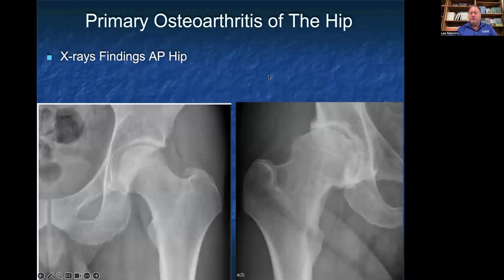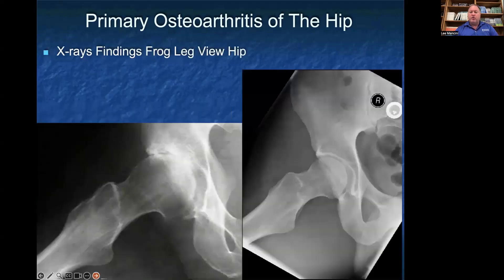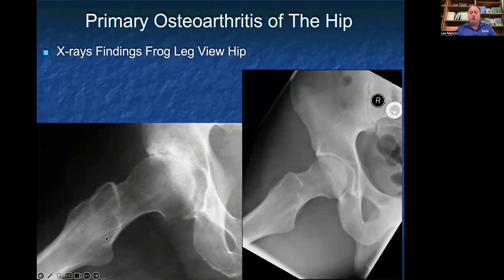On a regular AP view, you can look for joint space narrowing. You can see a normal hip x-ray on the left and on the image on the right you can see arthritic changes with increased sclerosis and decreased joint space. For x-ray findings on the frog leg view, you can see that decreased joint space and increased sclerotic changes, as compared to a normal, healthy, non-arthritic hip joint.